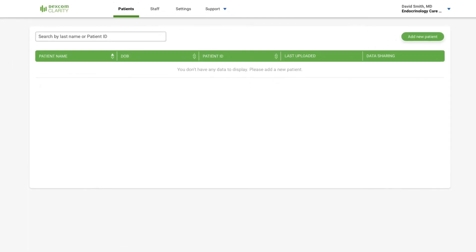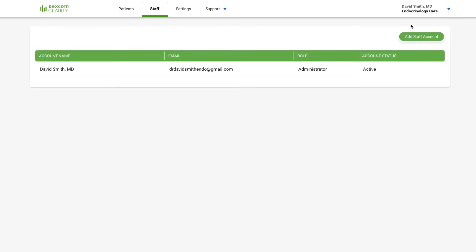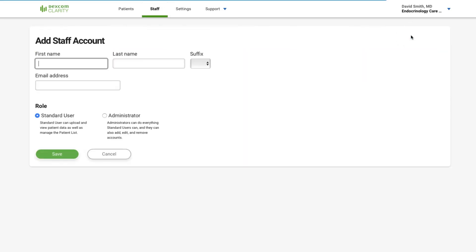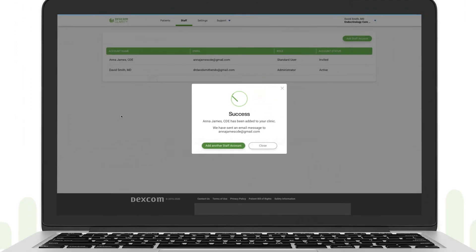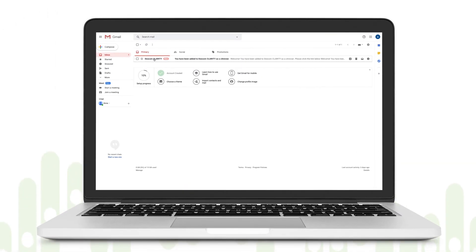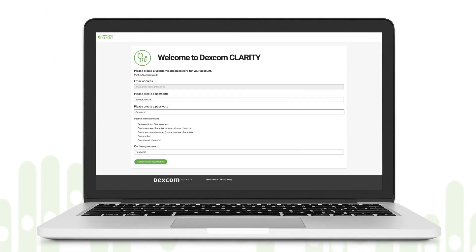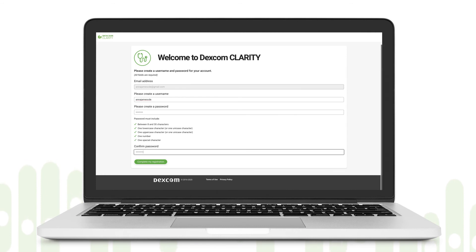Let's add someone. Click Staff, then click Add Staff Account. Enter the person's name and email address. Choose a role for them — Standard for adding and viewing patients, or Administrator for additional control of staff access and clinic settings. Then click Save. Your staff member will need to accept the activation email and create their own username and password.